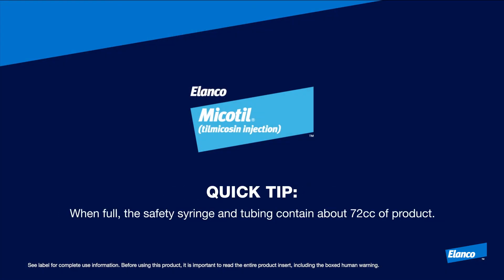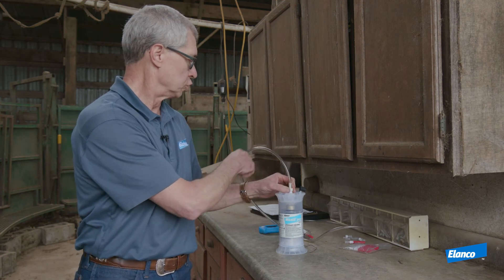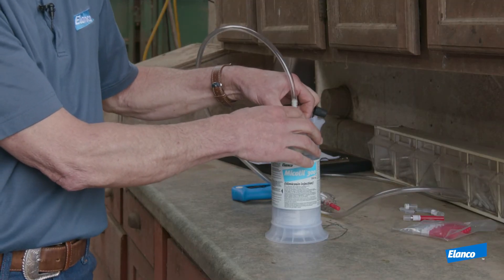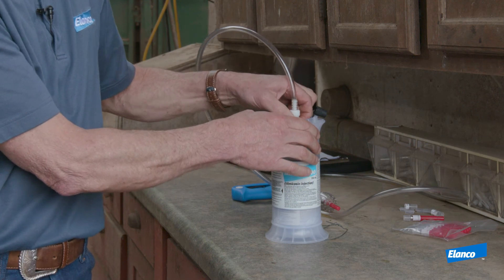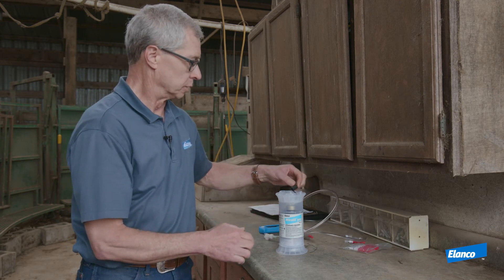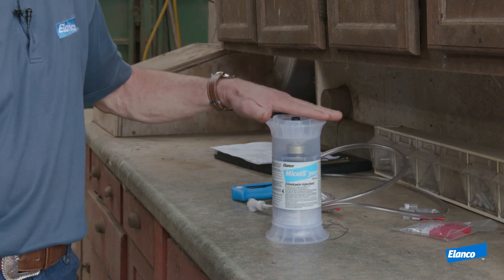When you're finished with all of your cattle processing and your Mycotill bottle is empty and your tube and syringe are empty, to remove the quick release coupler off the shroud fitting, just place your finger on the silver tab, push it in, and simply bring it right off — it comes off very easily. Put the black cap back on the bottle and then dispose of this properly.